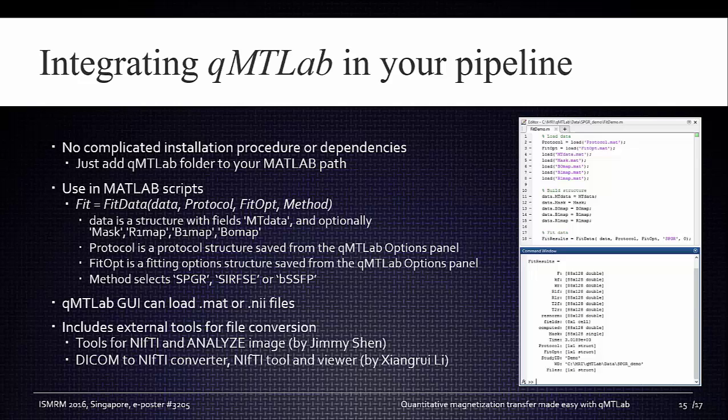For example, if you don't want to use the graphical user interface, you can easily fit your data using a single line of code. Also, using the user interface, you can load mat files or NIfTI files directly. Also included in the software are external tools for file conversion. For example, there are tools for NIfTI or Analyze image conversion, or a DICOM to NIfTI converter.